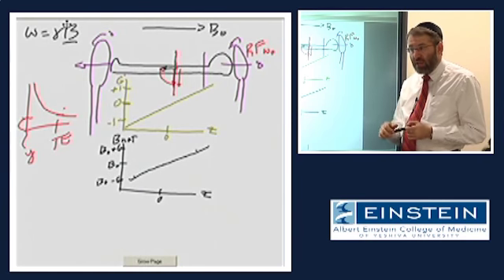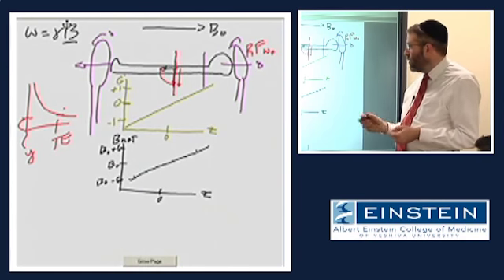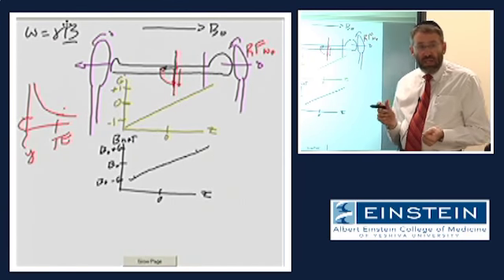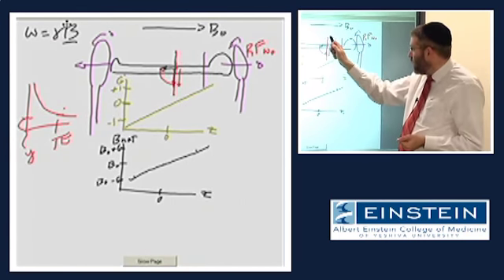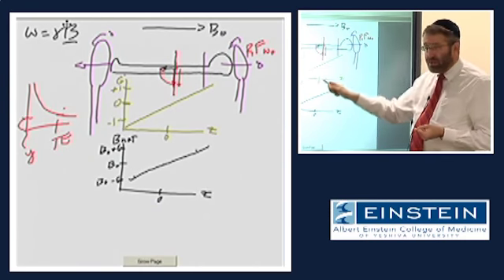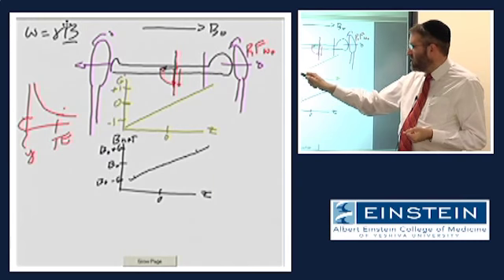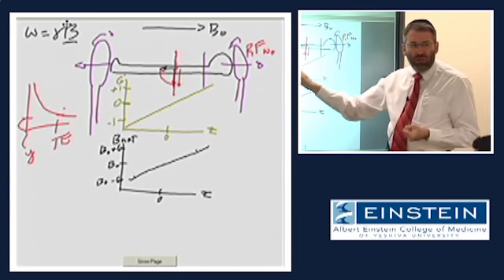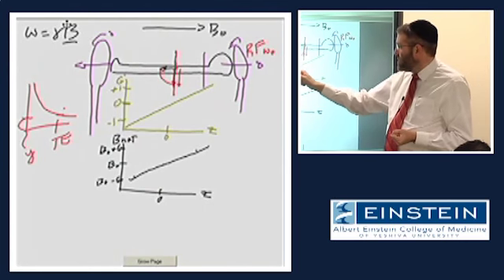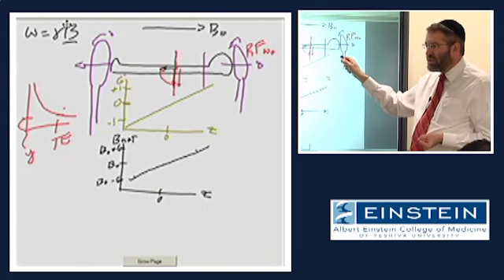So how can you do that? How could we select a different slice? Someone was going to... Change the frequency. Exactly. So the frequency of precession in the presence of the gradient magnetic field is omega naught at isocenter, but it varies continuously as we move in this craniocaudal direction. Okay? And it moves in a predictable linear fashion.